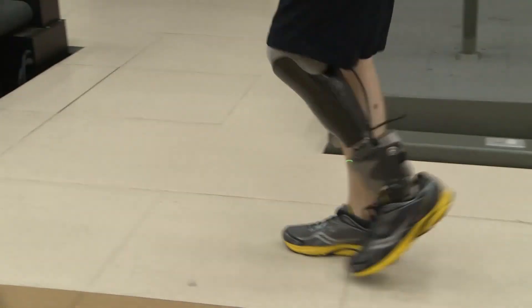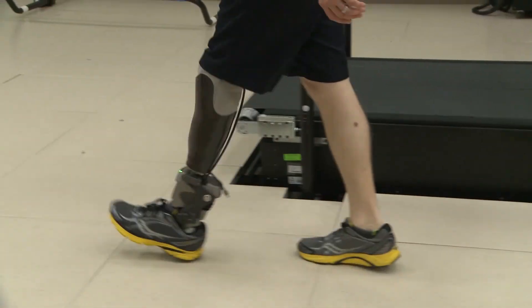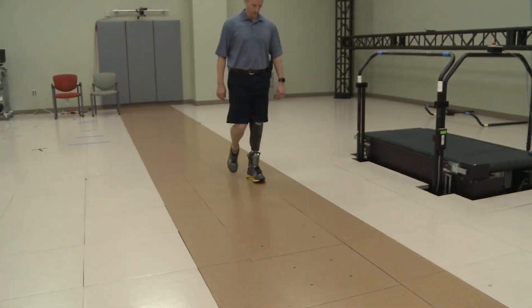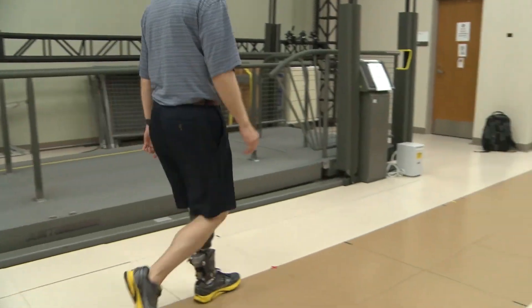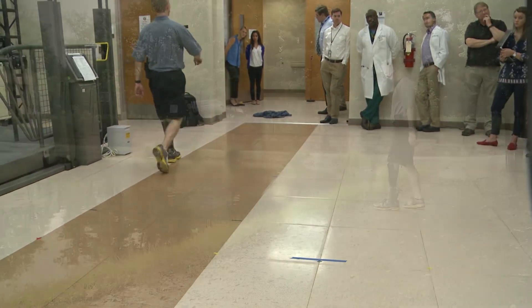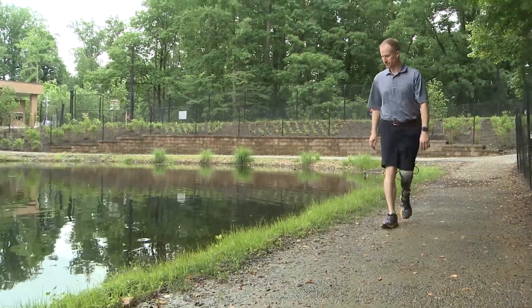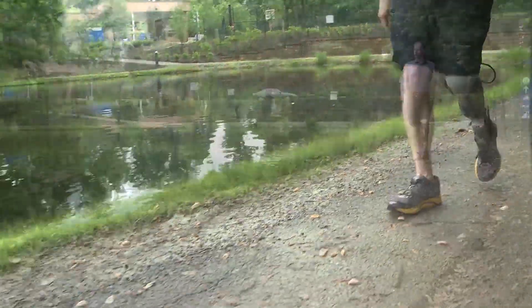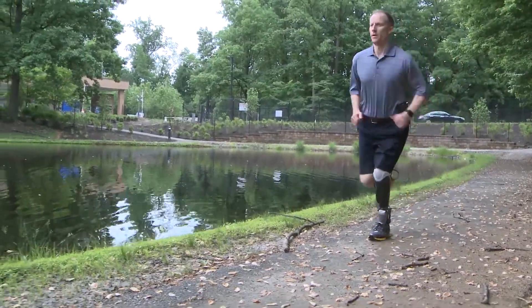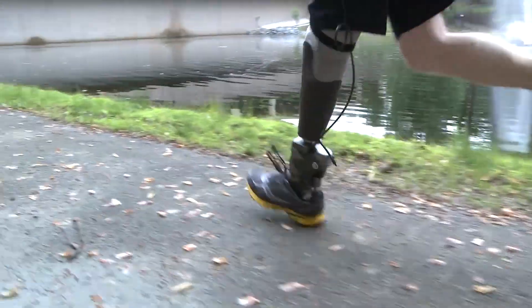The battery life is 4,000 continuous steps. Currently the battery is worn on the hip, but future iterations would integrate the battery onto the device. The battery would also get much smaller because lithium-ion cells have recently increased in energy density, which is going to shrink the battery size down significantly.